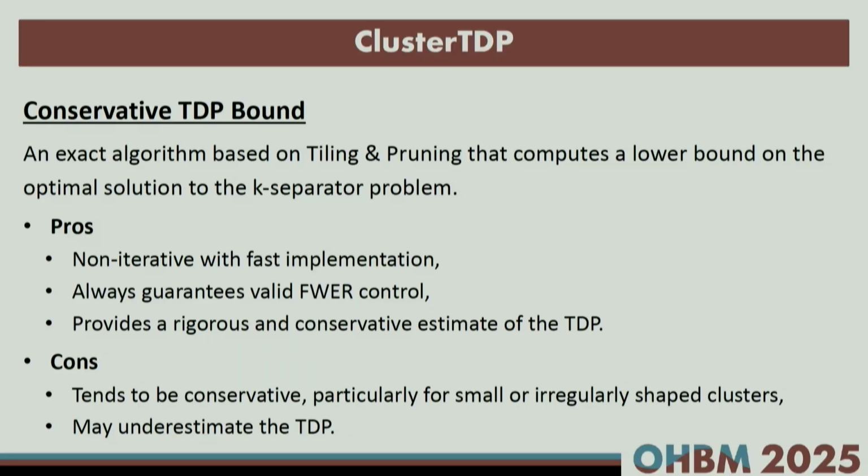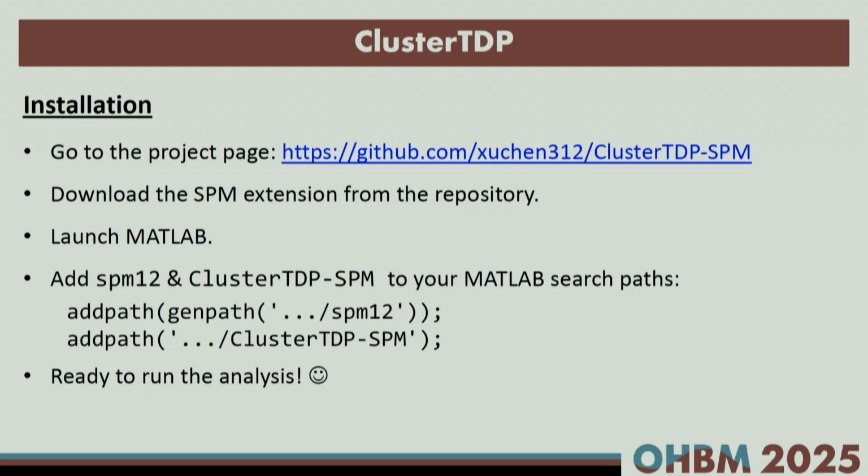So how can you run this cluster TDP tool? First of all, please visit the GitHub repository webpage to download this SPM extension and then launch MATLAB. Then the next step is to add the SPM12 and cluster TDP SPM tool to your MATLAB search path using the following commands, and then you are ready to go.